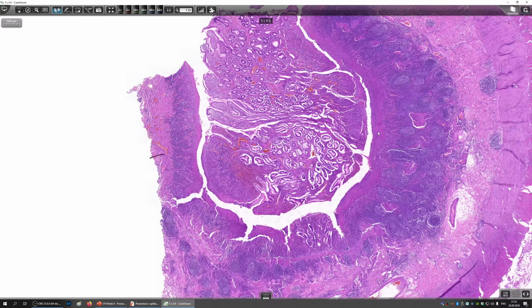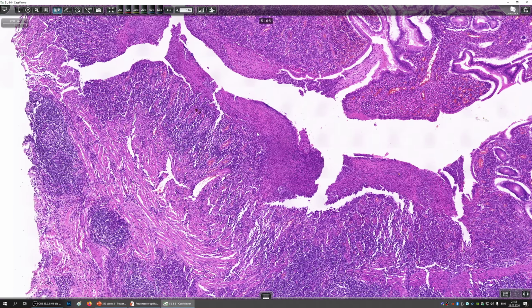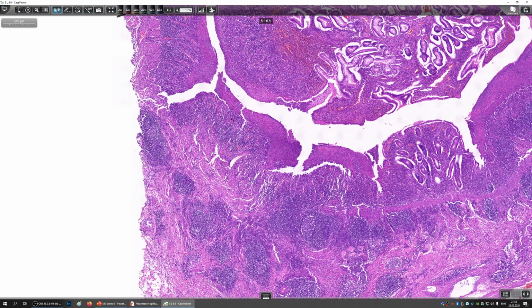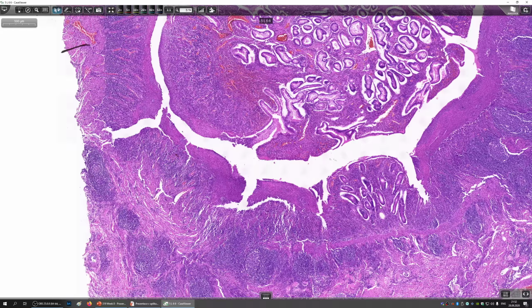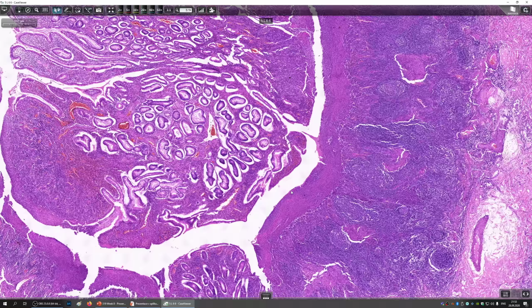So the sign of activity is usually ulceration of the mucosa, that we can see plenty of ulceration here, also in other parts. This disease is characterized by multiple episodes, multiple flare-ups, and periods of remission when there is no activity, there are no ulcerations, and after multiple of these episodes, the mucosa becomes extremely scarred. Here you see an area where you have some crypts left, and the other areas where the mucosa has completely lost its architecture.